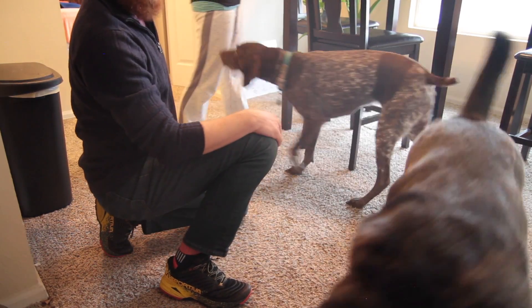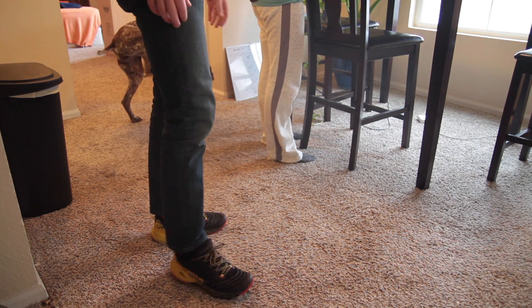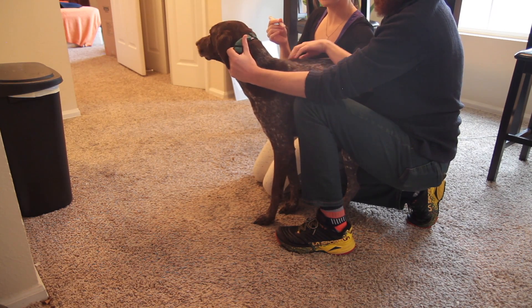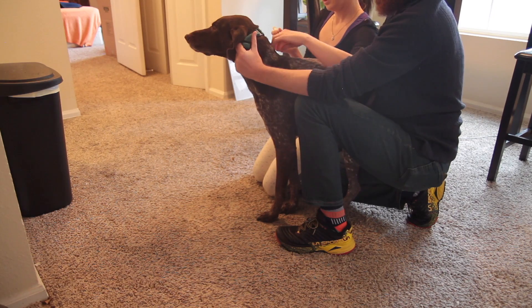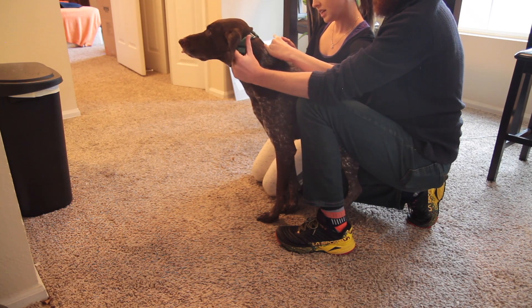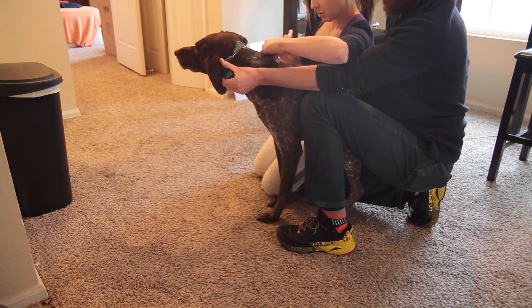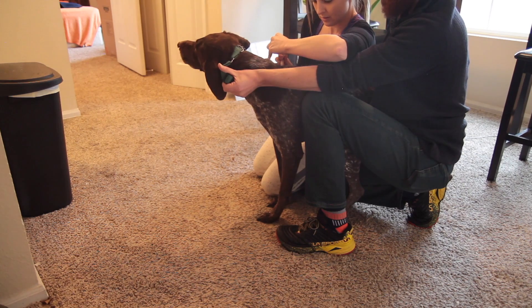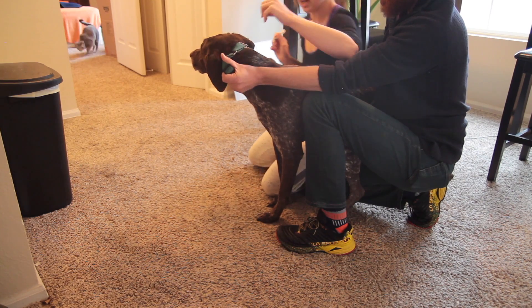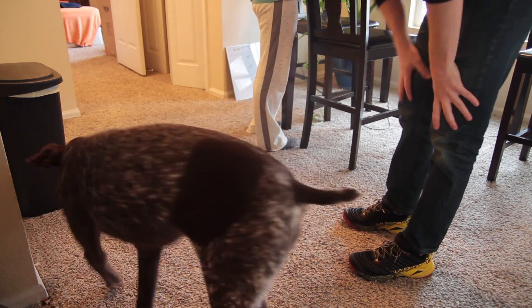Hannah didn't even feel that. Literally, she did not even feel it. So I'm going to go at the back of the neck where their scruff is — not on the spine. You want to avoid the spine. She's shaking, so I'm going to pull up the skin and make a little indent with my finger. She's nervous, so I'm going to go because she's nervous. Pulling back to see if there's any blood — there's none. Pushing the vaccine in and we're done. Good job, Sophie. Her skin clumps a little bit.